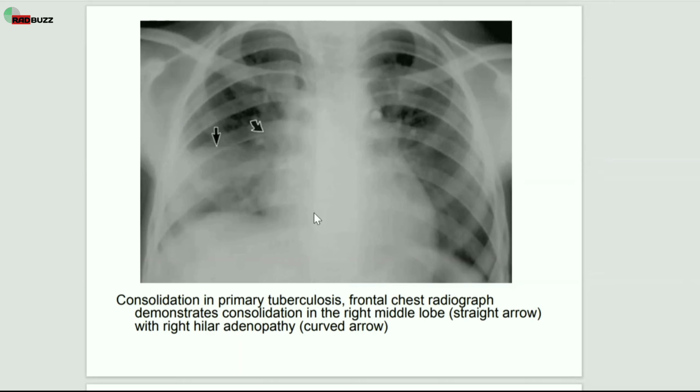Even in some patients, only nodes are present, like sarcoidosis. We had a detailed discussion about sarcoidosis and its stages, where nodes started, and in pulmonary fibrosis, the nodes eventually disappear. TB has nodes which are centrally necrotic; they don't calcify in active TB. Old TB nodes do calcify, with central calcification, whereas the nodes in sarcoidosis have eggshell calcification. That's the difference between the calcification of two different types of granulomatous nodes.